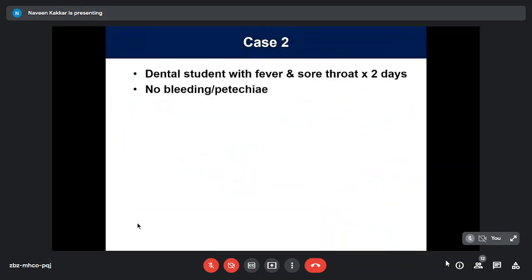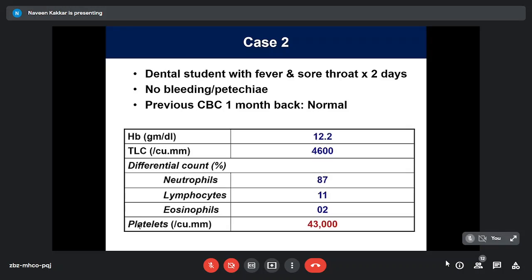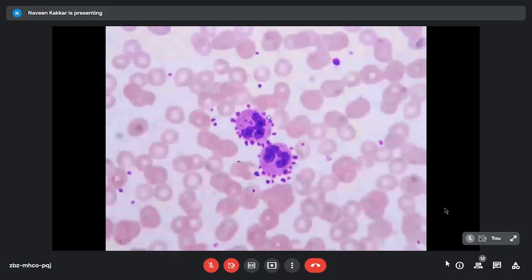A BDS student with us with fever and sore throat for 2 days. There was no bleeding or petechiae. Previous CBC one month back was normal. His count now showed a normal hemoglobin, TLC of 4,600, normal differential, but with thrombocytopenia. No bleeding symptoms. This is what his blood smear showed, a phenomenon which is very familiar to many of you: platelets sticking to the neutrophils there.